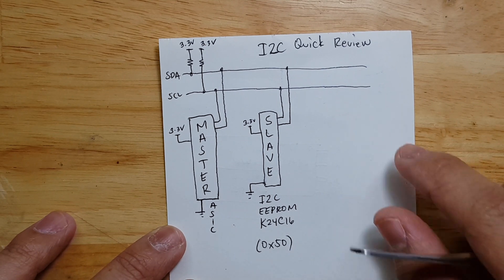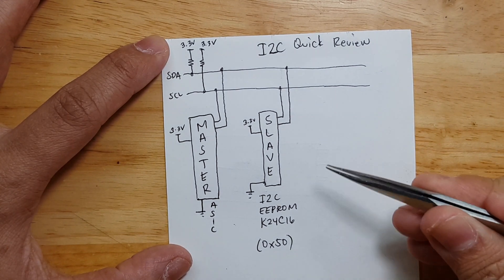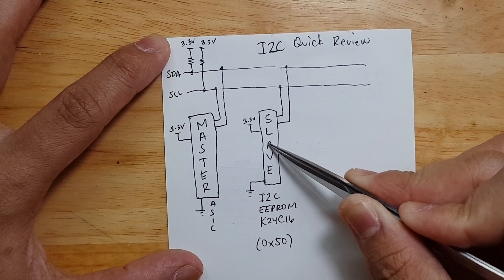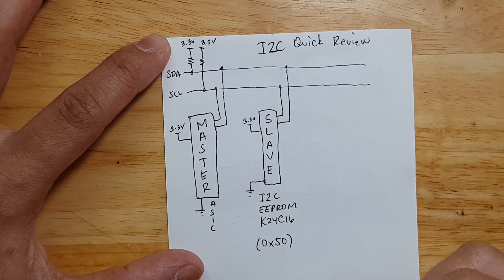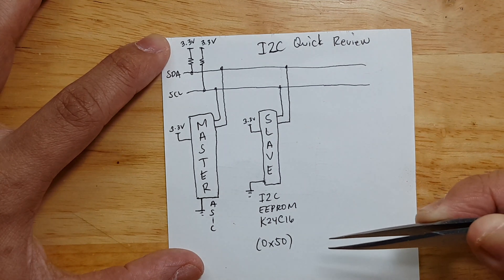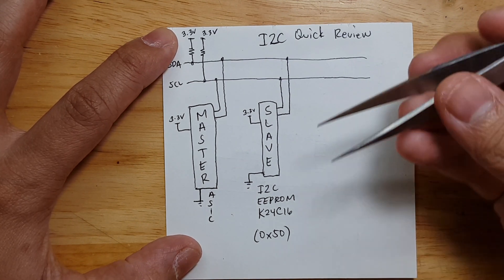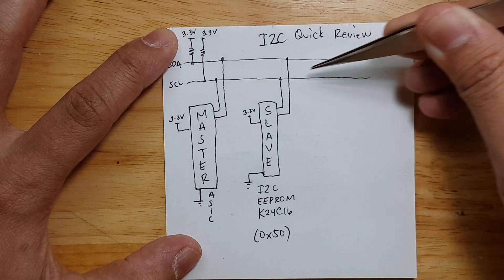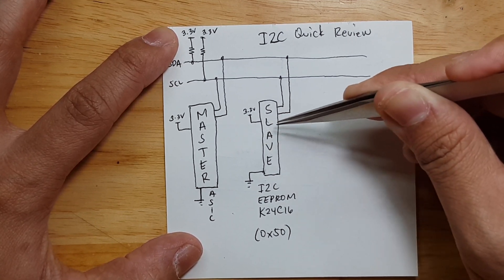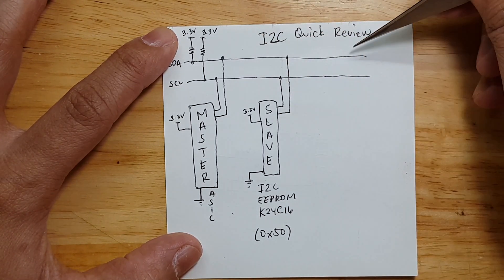As previously discussed in our last video about hacking the blood pressure monitor, the I2C EEPROM with this part number is connected to an ASIC of that blood pressure monitor. This ASIC, the one that is the master, is transferring information to the slave. So there are 2 ways how we can bypass that data: we can either have an Arduino as a master and try to do some arbitration to get the specific address location, or we can make the Arduino as a slave and just listen on the I2C bus.